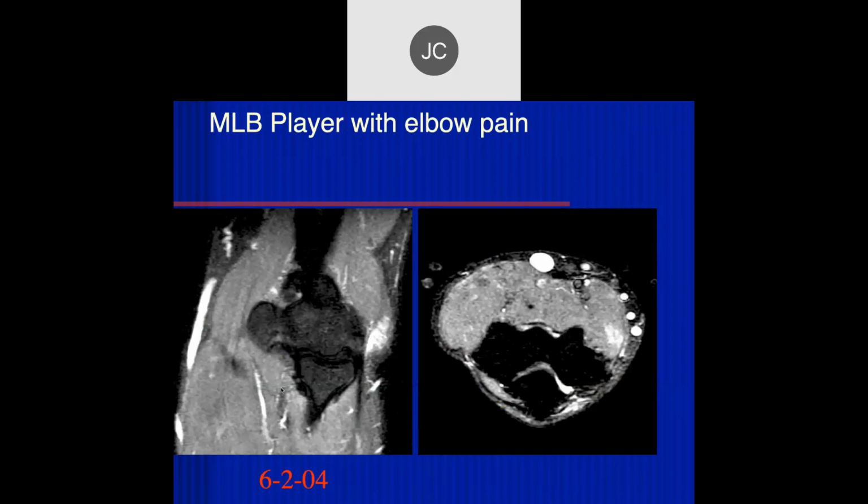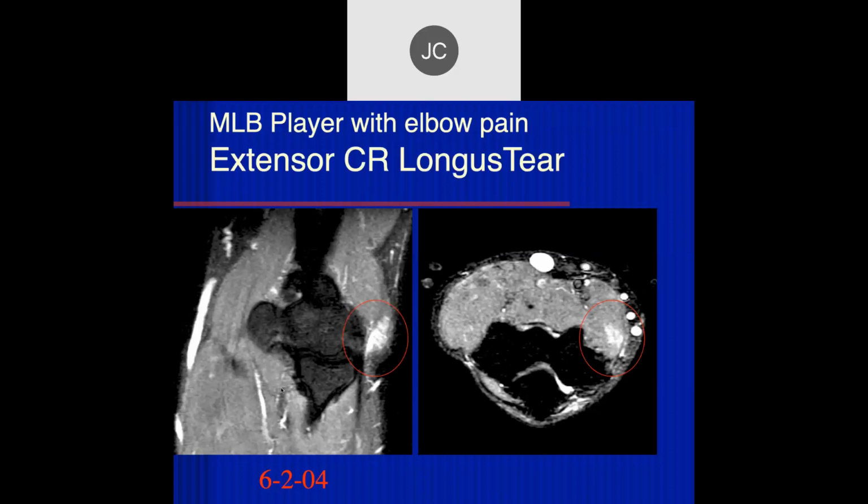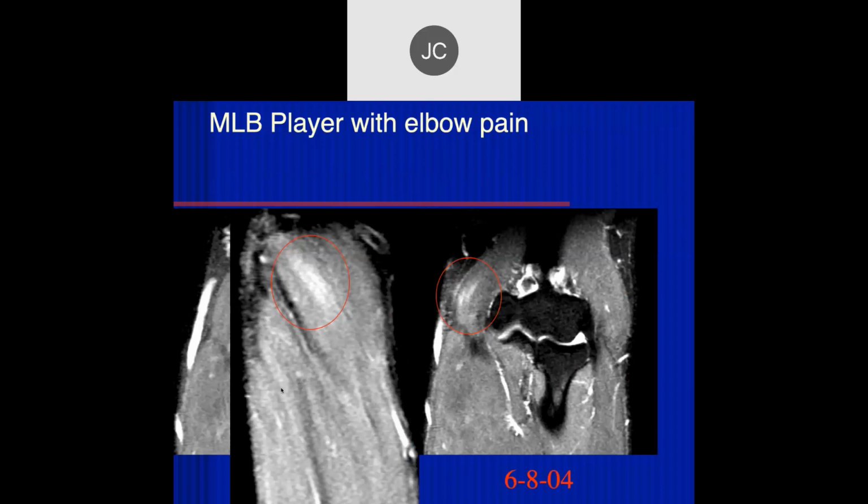Elbow pain. I see edema on the lateral side within the muscle. So this one's 6204. This is actually an extensor longus muscle over there. It's extensor carpi radialis longus. So that's on 6204. Now the patient came back 6 days later, and this is what it looked like.